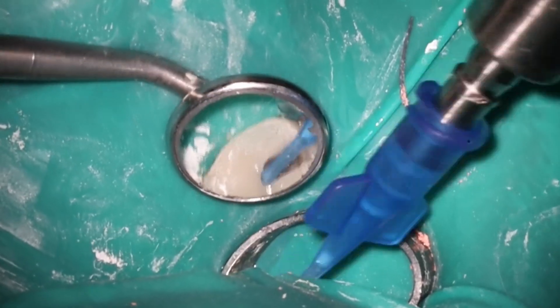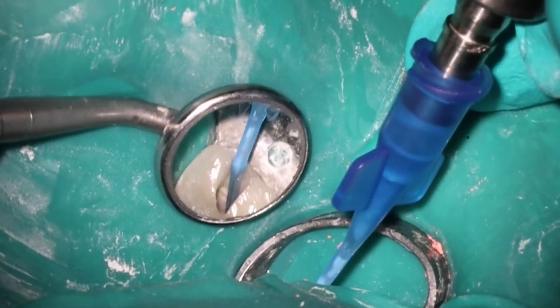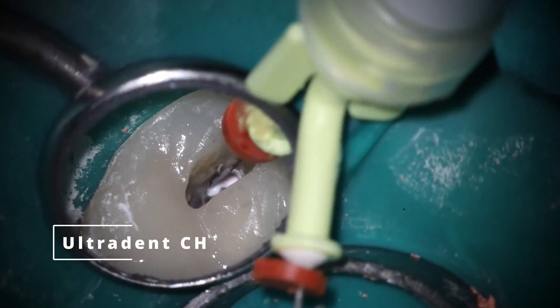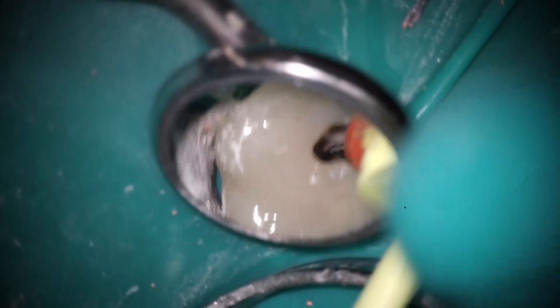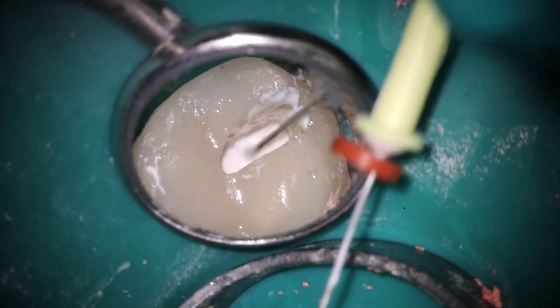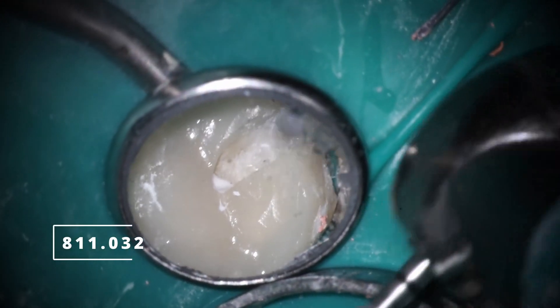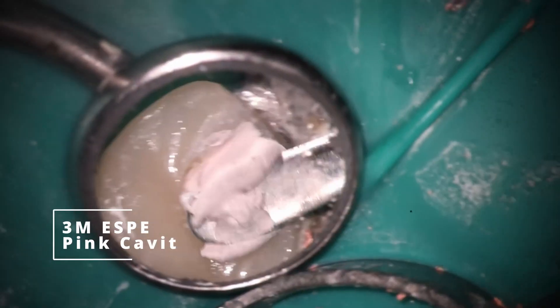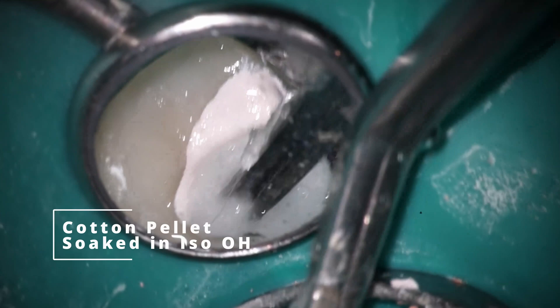One thing I like to do with nasty cases like this is use the micro suction a lot. If you don't have an ASI cart, you can get a hookup that attaches to your regular high-volume suction. It's really important to try to get as much of that infection out as possible — this gives more room for the calcium hydroxide and removes irritants. This is kind of why the gentle wave idea causes less post-op pain — the heavy suction removes pro-inflammatory factors. On big nasty cases I like to fill the entire chamber with calcium hydroxide. When I put the cotton pellet in, it acts like a plunger pushing it apically, and gives you more of a reservoir of calcium hydroxide.